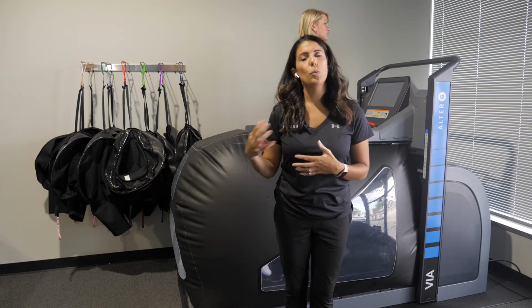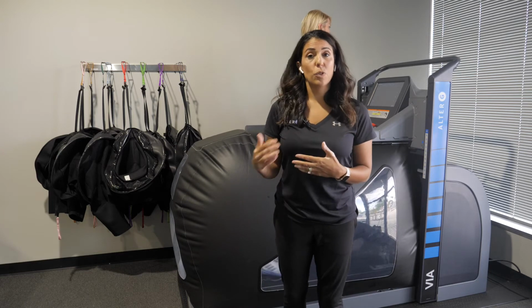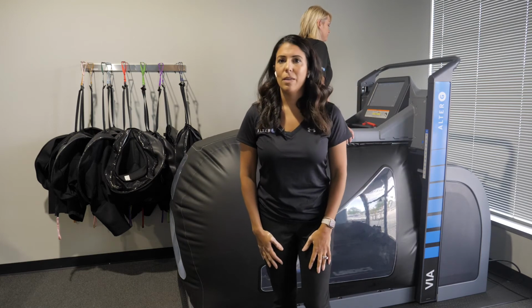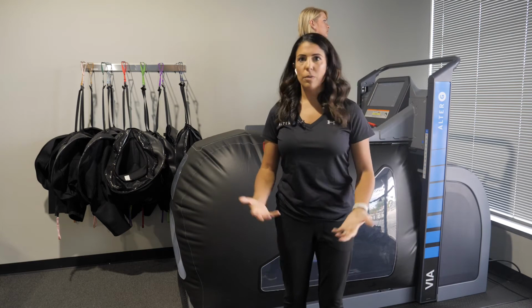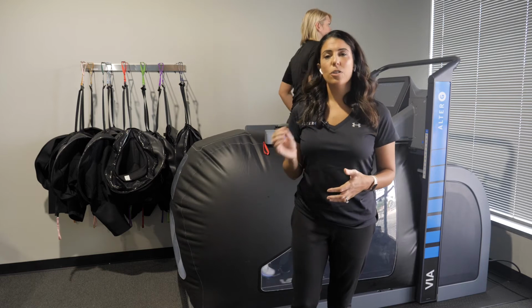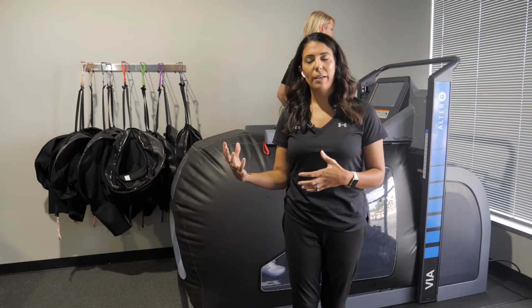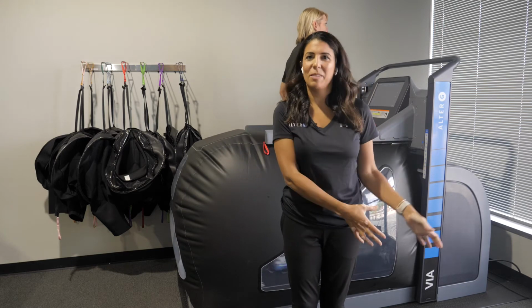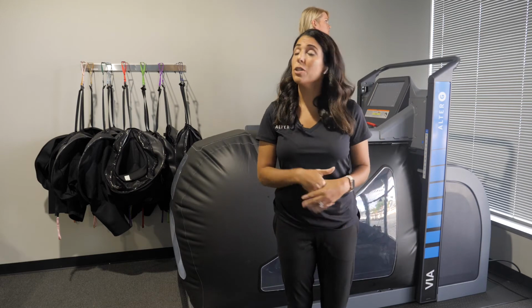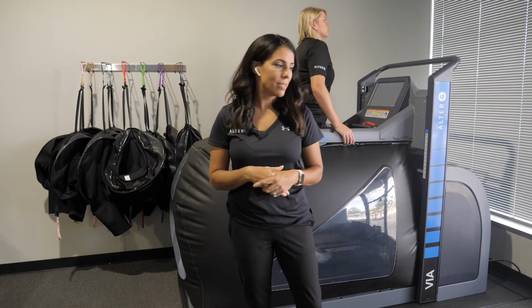Ideally, we don't want to remove too much body weight. You just want to remove enough body weight where their gait improves closer to normal. So if you have somebody who has an antalgic gait because of pain from, again, maybe a post-injury, post-surgery, or osteoarthritis, and they have a decreased symmetrical gait pattern as a result of that, you just want to unweight until their gait symmetry starts to improve. If we start to unweight too much, we're never going to get there. The goal is to get them to walk over ground. So we want to progressively load them as they start to improve so that eventually we can get back to over ground. It really is just a modality, a training tool to allow us to get to that next step.